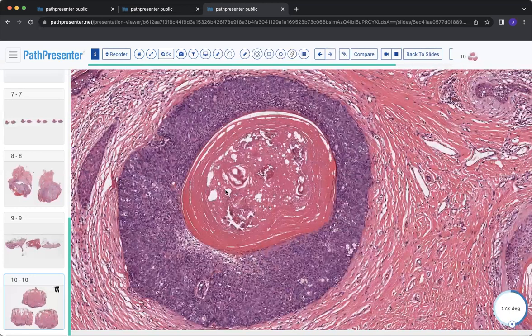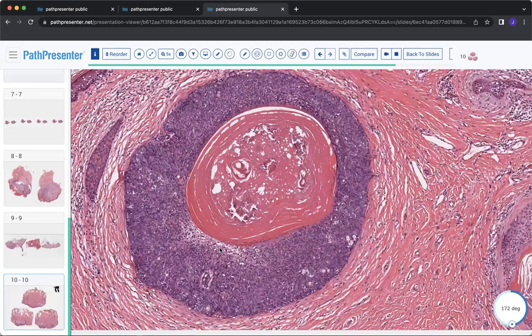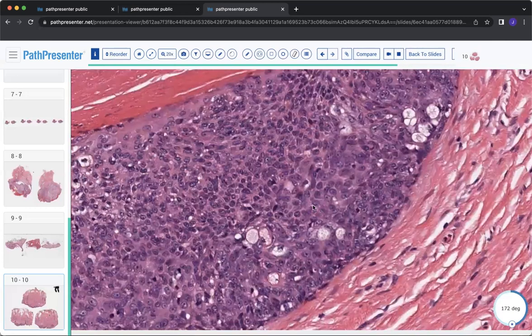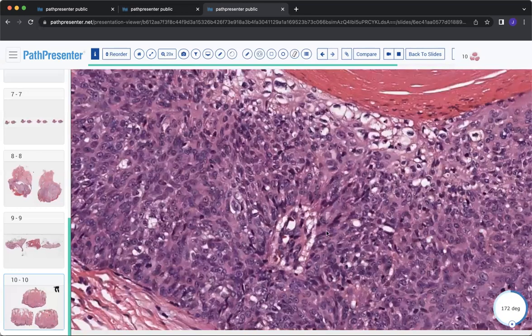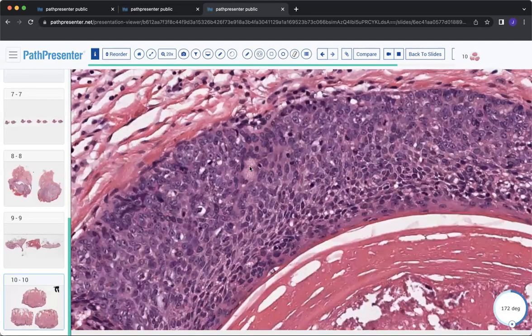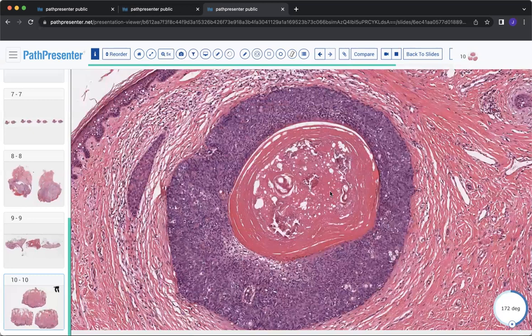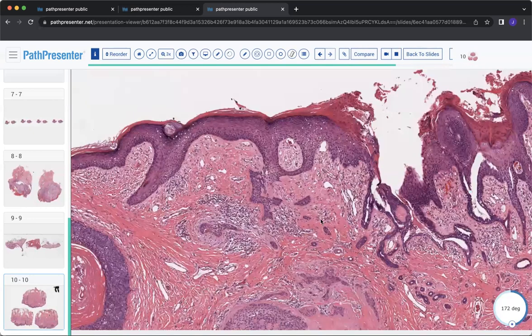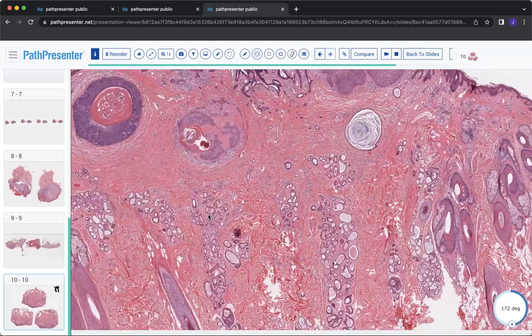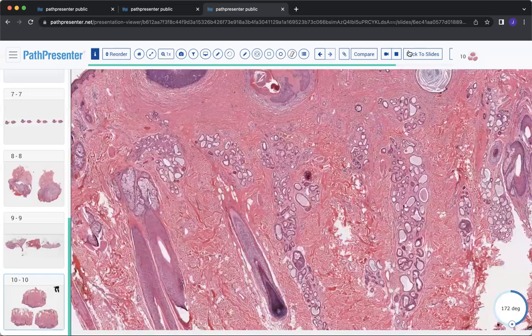This is probably a neoplasm related to your trichoblastoma, or maybe even an early developing basal cell carcinoma. It's hard to say. With that mucin production, definitely could be an evolving basal cell carcinoma. Like I said, the cells don't look terribly neoplastic in nature. They look more monotonous here. So this was actually thought to be more of a trichoblastoma that was developing within a nevus sebaceous, which is pretty common. So trichoblastoma, SCAP, and trichilemmoma all within a nevus sebaceous. And again, that's just a cool, real example of a 4-in-1 for you. All right, well, that's all I have for this video.